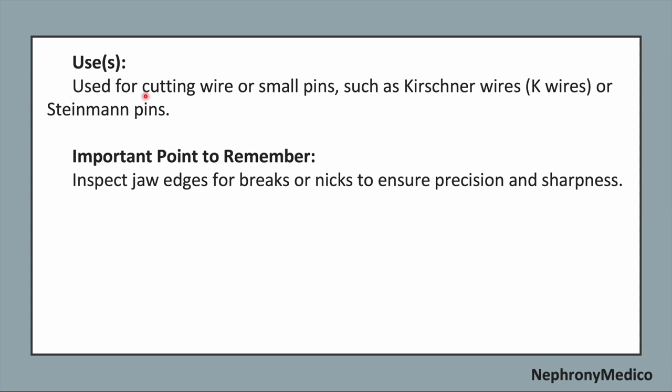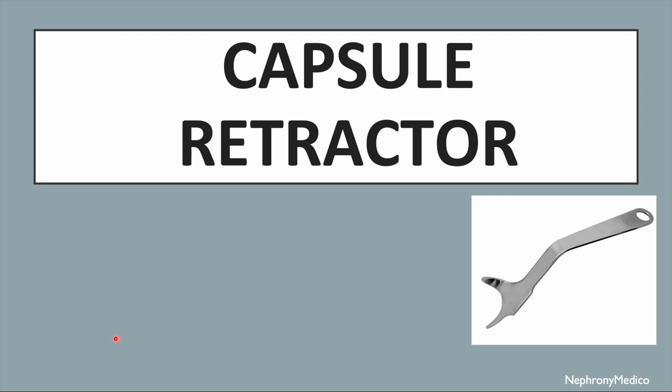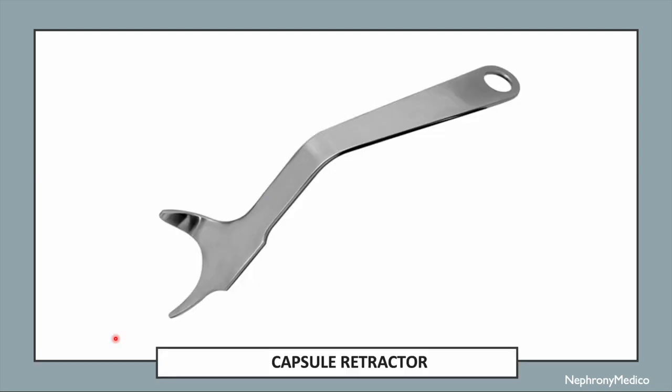Use: it is used for cutting wire or small pins such as Kirschner wires or K-wires or Steinmann pins. Now, important point to remember while using this instrument: inspect the jaw edges for breaks or nicks to ensure precision and sharpness of this instrument. Let's talk about capsule retractor. This is a picture showing capsule retractor.